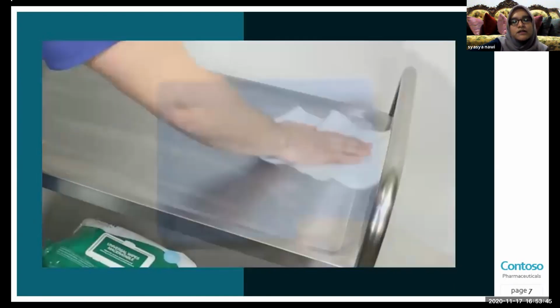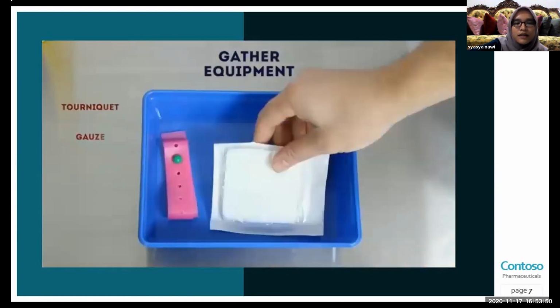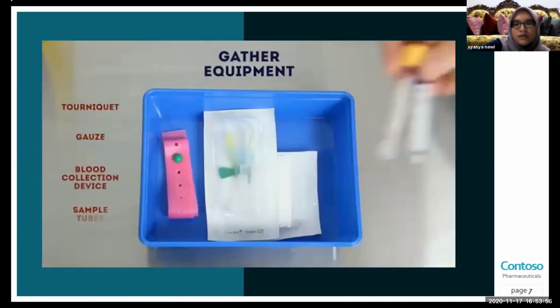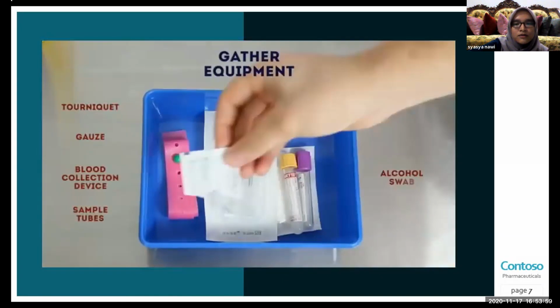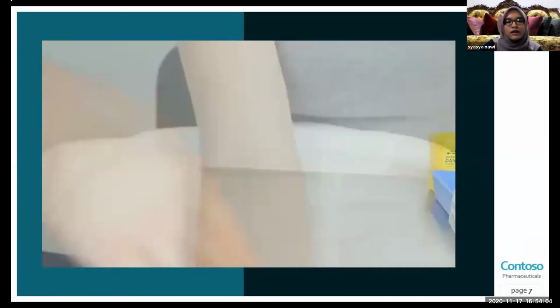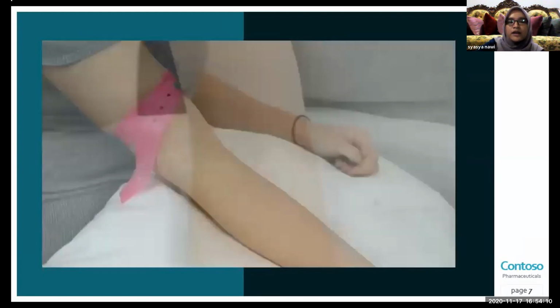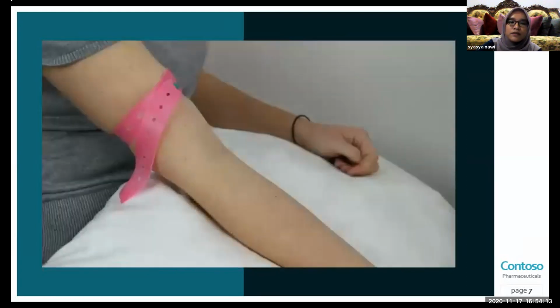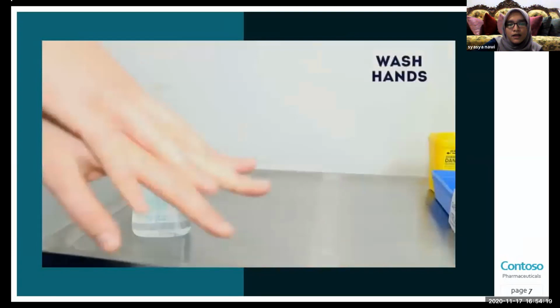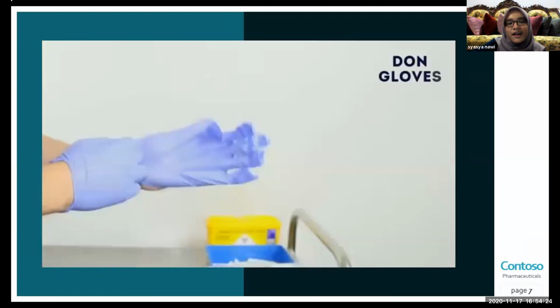And then prepare the equipment on a clean tray. Okay, we need the tourniquet, we need the gauze, just like the intravenous. But then we have the blood collection device and the sample tube, the alcohol swab, and also the plaster. Okay, we inspect for suitable veins, basically from the 3 veins that I've mentioned before. And then we apply the tourniquet just above the veins that we have chosen. After that, we palpate for the veins. And then wear the apron and the gloves.